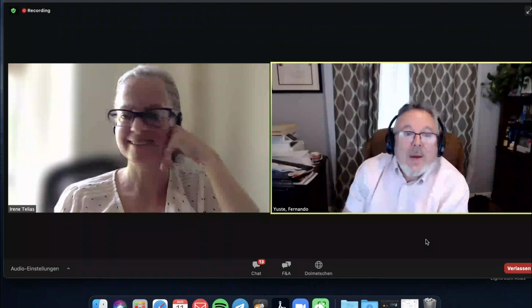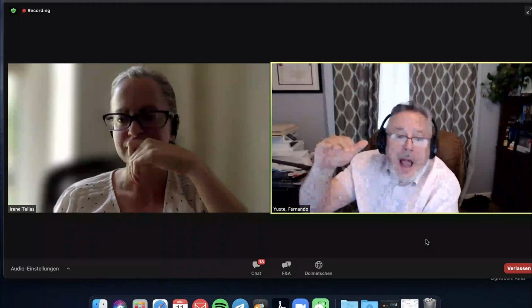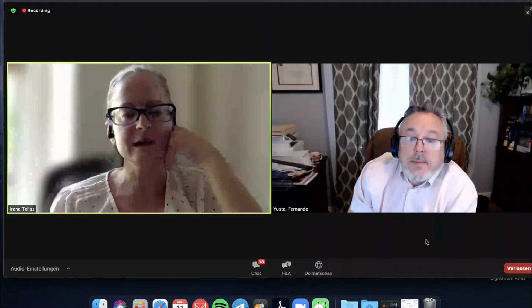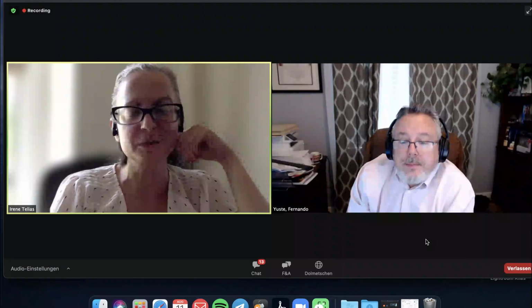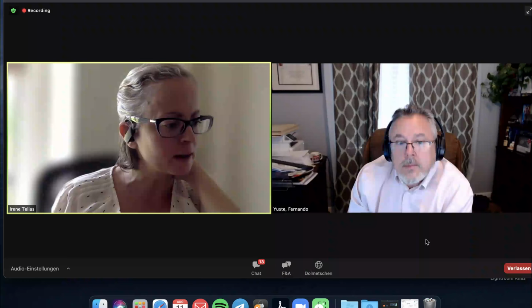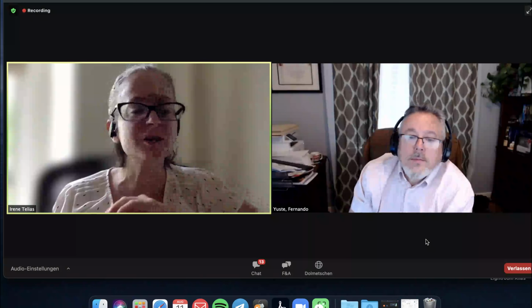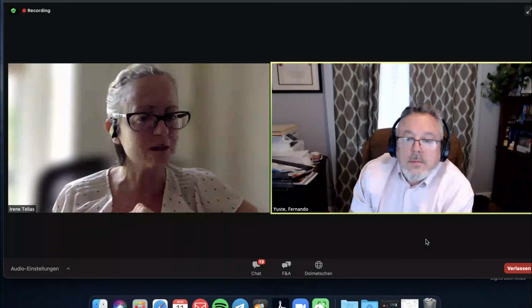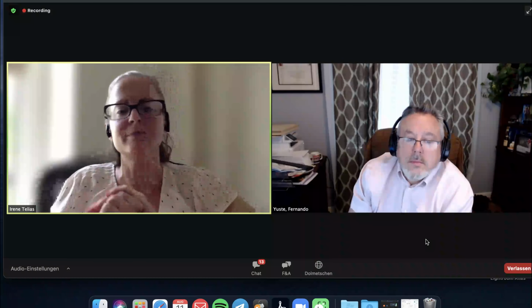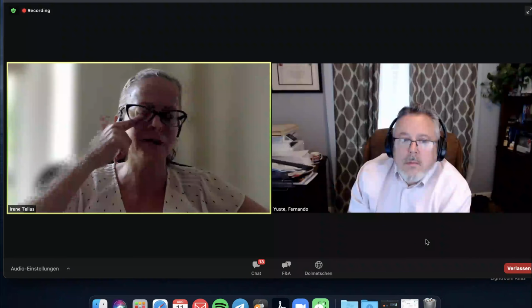I love it. Gabriel is asking, when there are low P0.1 and high POCC, what could be the cause of that? So the first thing I would check is if there's a technical issue with the measurement, because it would not be very common to have a low P0.1 and a high POCC. And then the other thing is that the patient might be especially sensitive to the occlusion itself. So maybe the patient's respiratory drive is not so high, but whenever the patient feels the occlusion, then the POCC becomes a little bit larger.